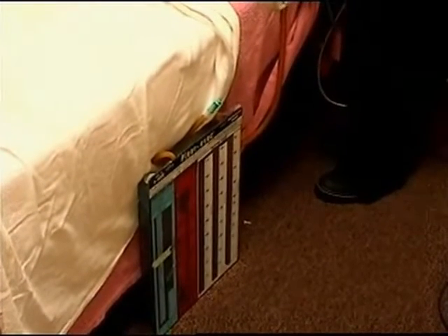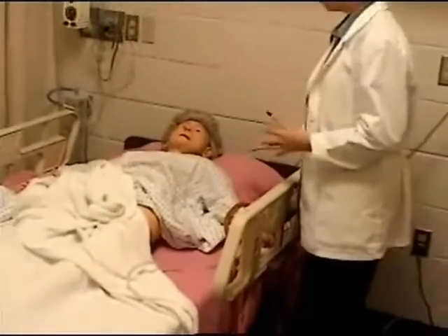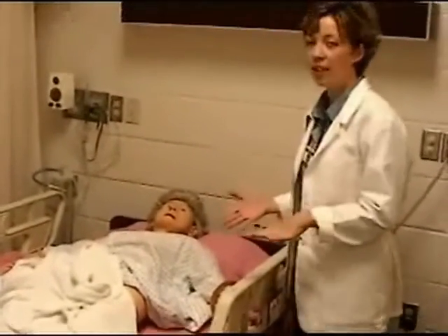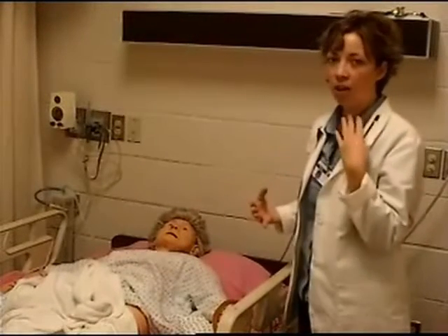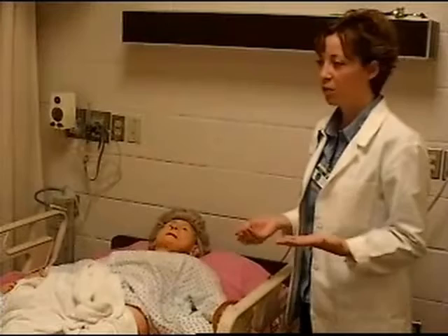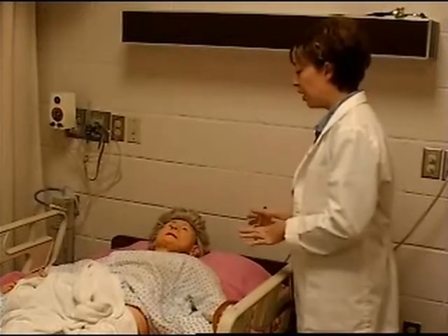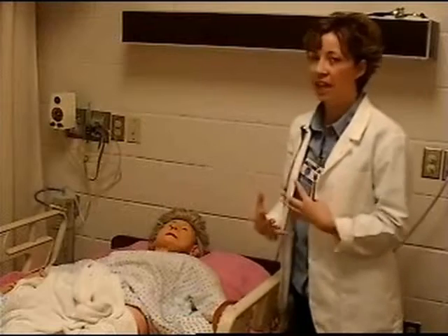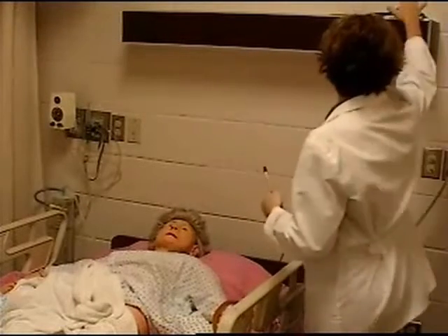You'll say, "Hi, my name is Isadora, and I'm one of the nursing instructors here at Calmar, and I'll be taking care of you today with my nursing student." Ask her if she's having any pain, and while you're doing that, you're looking at her. Is she gasping? How's her color? We're doing that assessment for respiratory distress, and that's huge. And Mrs. Smith is nice and pink. She's breathing normal. It's not labored. She's not grunting. I don't hear any wheezing.